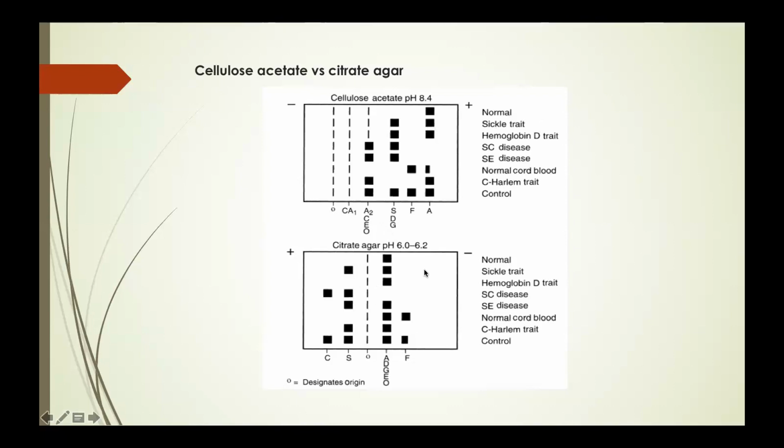Which means that now on citrate agar, hemoglobin A and F assume a positive charge, and hemoglobin S assumes a negative charge, plus C. C also has a negative charge, and they are migrating towards the anode electrode. You can know this person actually has sickle cell trait because of the band of S and the band of A. Maybe we'll discuss questions in class when we finish this section of hematology, erythrocyte disorders. I will bring some questions where these things apply, and you'll be able to understand.